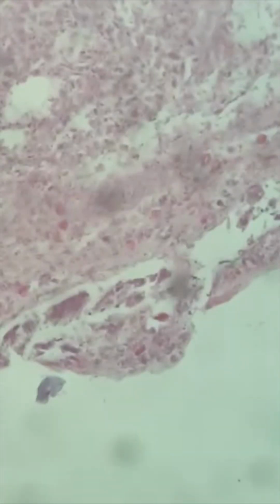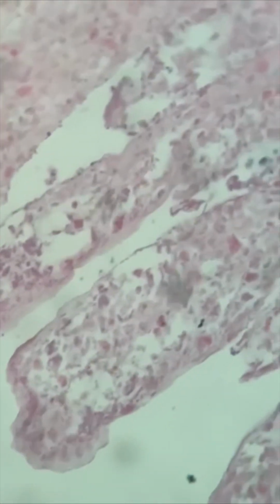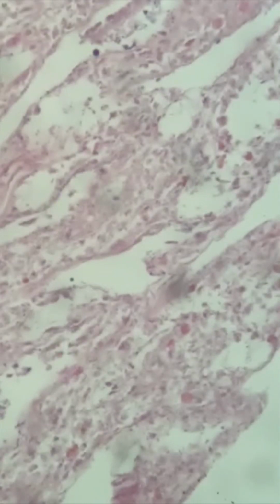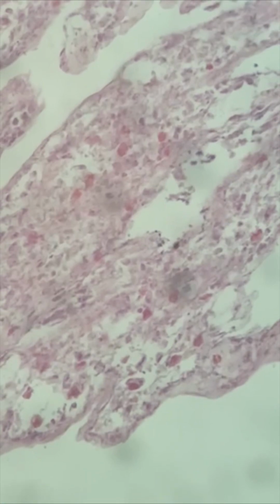Let me see if I can go down just to convince you that these are ischemic changes in this tissue, because you can see some extravasated red blood cells. You can see that the glands are all autolytic or dying. While it doesn't come into view here, there were definitely some extravasated red cells, but this is definitely ischemic change too. So not all autolytic changes from dying due to post-mortem decay.